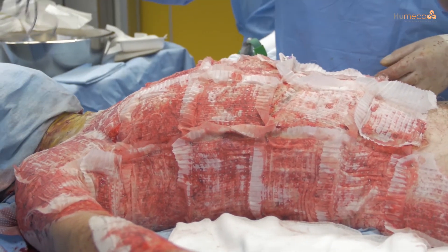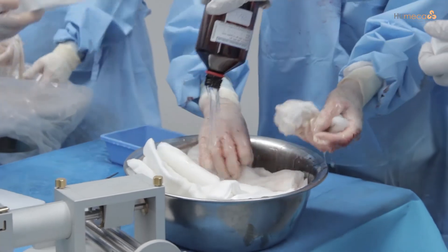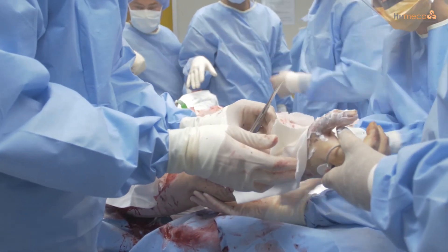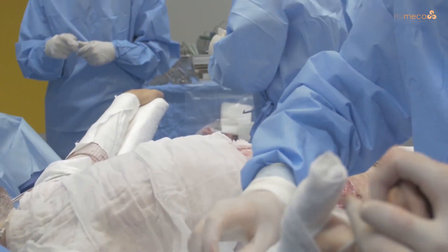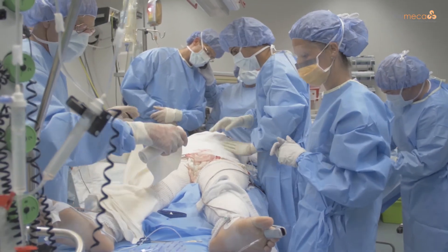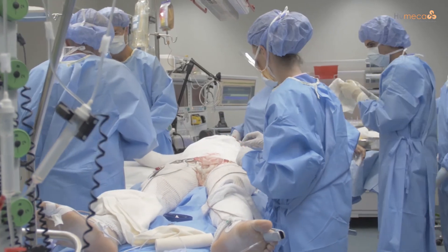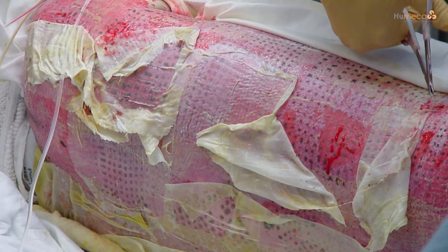All graft islands are correctly oriented to the wound bed in a regular pattern. The distances between the islands are relatively small, resulting in fast epithelialization rates. Local therapy after the Meek technique is normally no different from the therapy used when applying mesh grafts. To have the graft take well, the wound bed is kept moist with suitable outer dressings after transplantation. These outer dressings should not be changed for the first 48 hours. After this period, outer dressings may be changed daily, but leave the Meek gauzes in place. The Meek gauzes should remain in situ for six to 14 days. To facilitate removal, one percent silver sulfadiazine (SSD) cream may be put on the gauzes one day prior to removal.